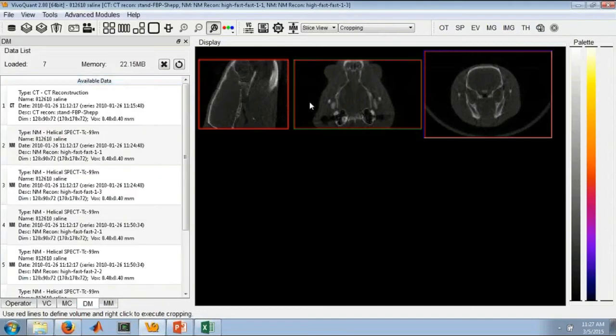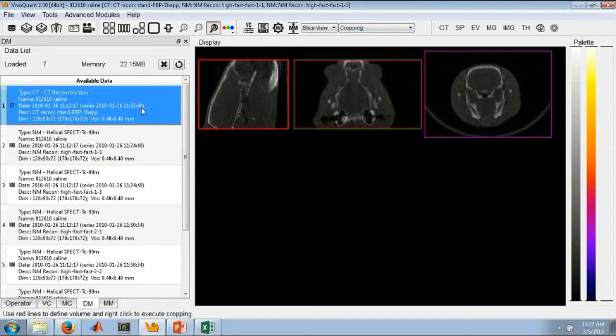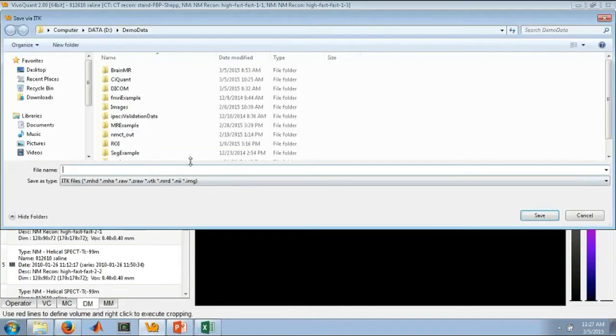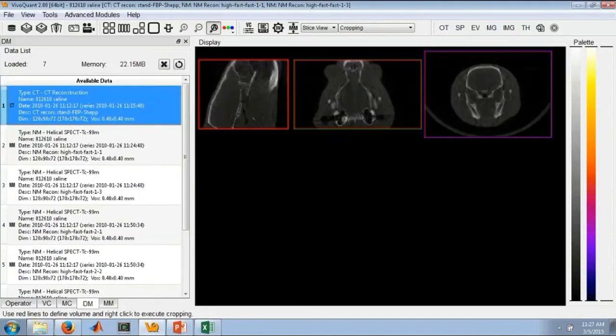The last thing that we've added in terms of your preprocessing is just the ability to save data. As much as we always have been able to, we've just added some additional formats to the ITK saver, particularly the ability to save in NIFTY.